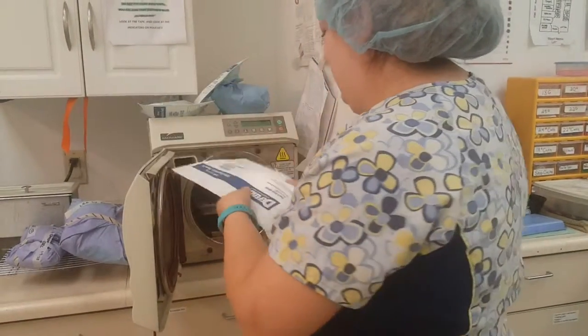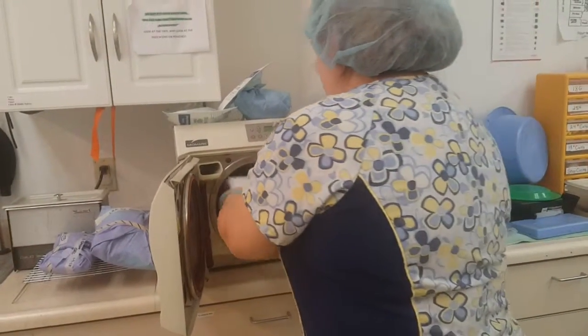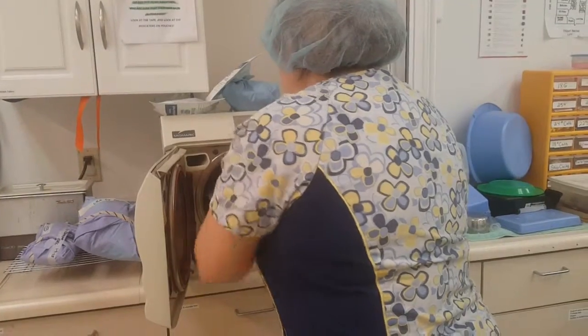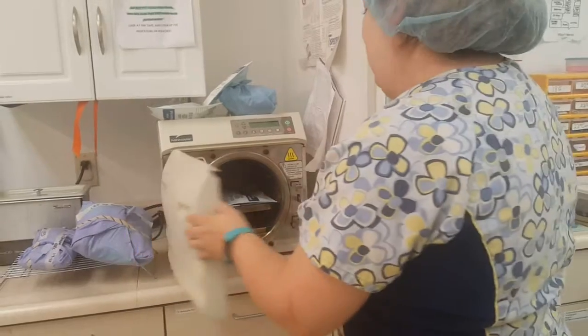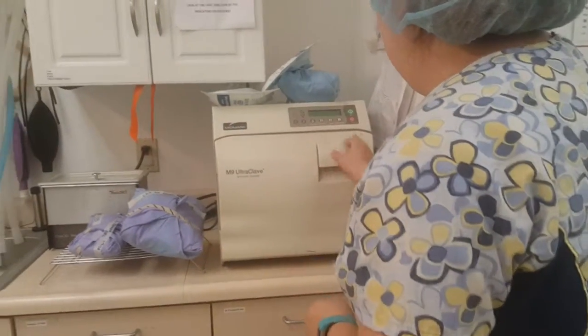I'm going to make sure that all of our instruments are on opposite sides of each other. Make sure nothing is touching the sides. If it feels good, I'm going to go ahead and close our door.